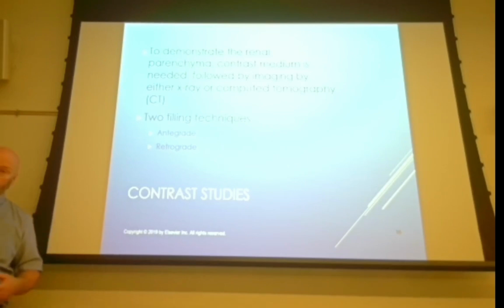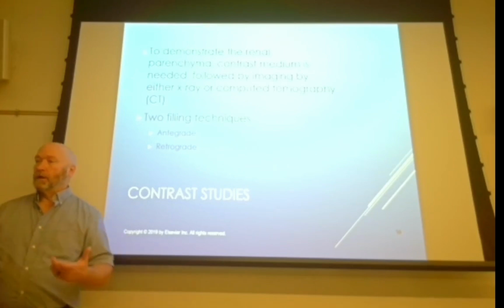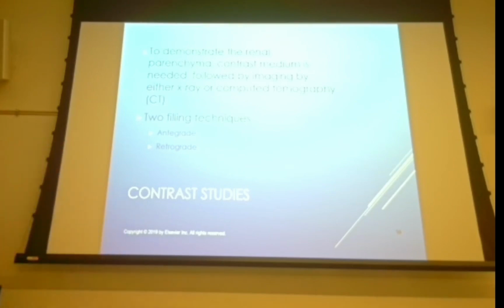Antegrade is we're going to inject the contrast into the patient's veins, and we're going to watch how well the kidneys pull that contrast out of the blood flow. So antegrade and retrograde, and we've got a lot of different studies we're going to talk about. All right, so here's where I was talking about before.